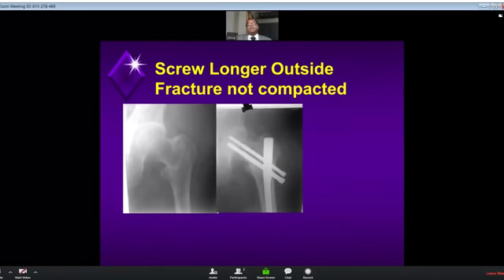What happens if you don't release the traction? The fracture gap becomes less in the immediate post-operative X-ray, and both the screws come out, and it will be seen as a prominent screw outside. The patient will not be able to sleep on that side. The osteoporotic patient, even if they sleep on that side, that causes the rocking of the screw in and out.